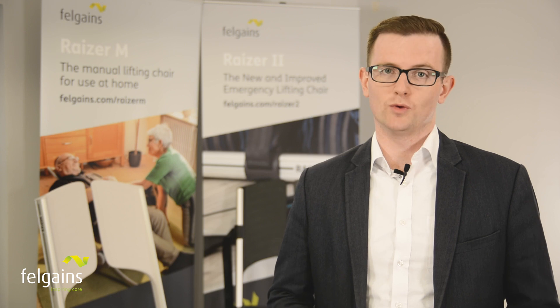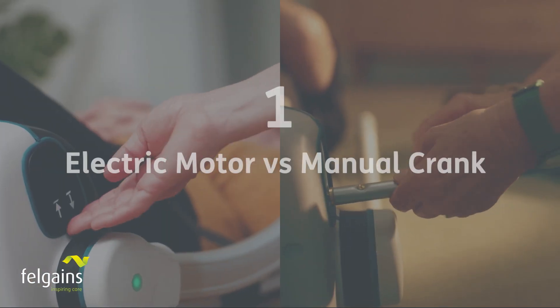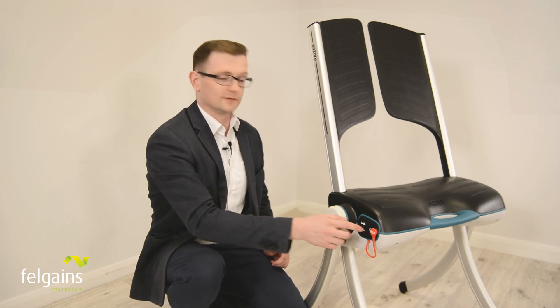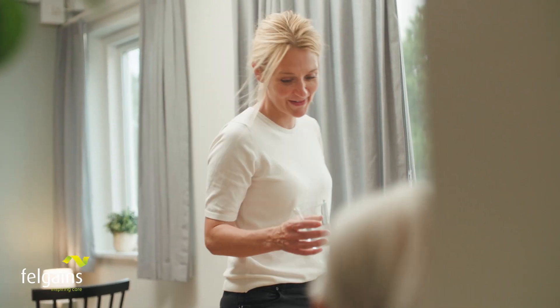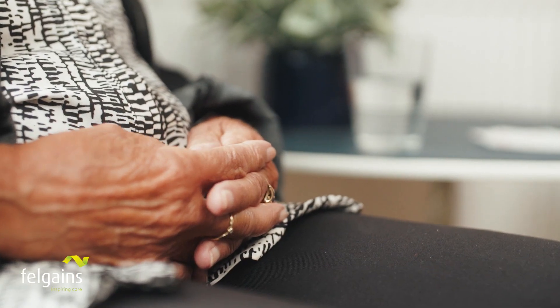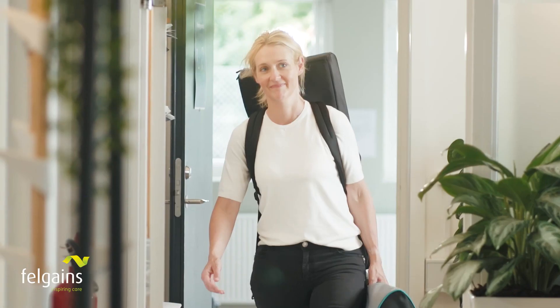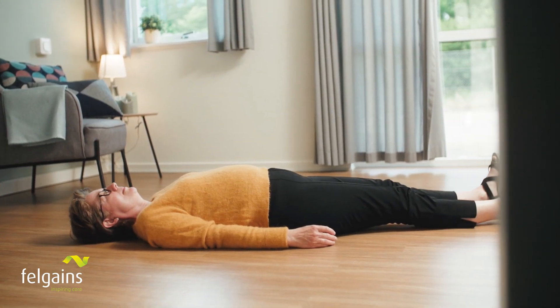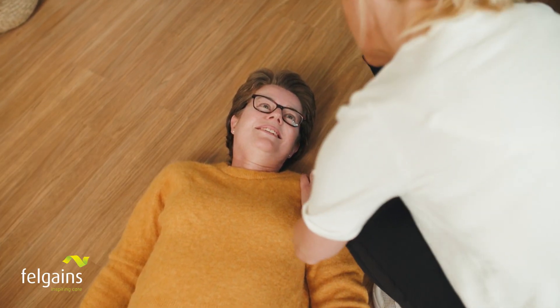So which is best for you and your situation? Let's dive into the three key differences between the two models and what each means for you. The most obvious difference is the lifting method. The Razer 2 uses an electric motor. This is for organisations that are lifting fallen persons regularly and need to reduce manual handling — including response services, health and social care applications, and care homes. The Razer 2 is also good for private individuals who want the peace of mind they would always be able to lift their loved one, as it takes next to no physical effort.